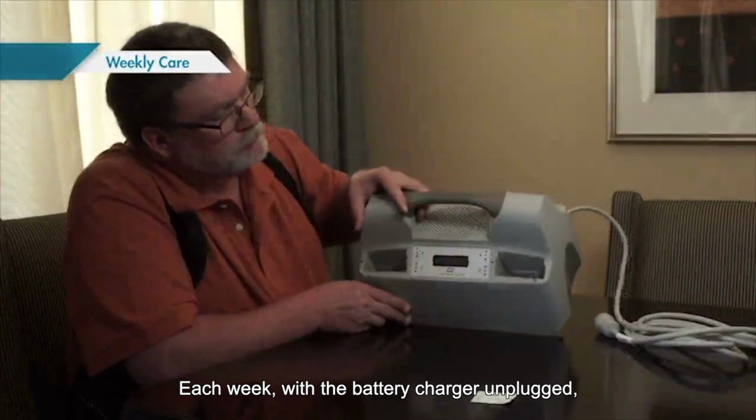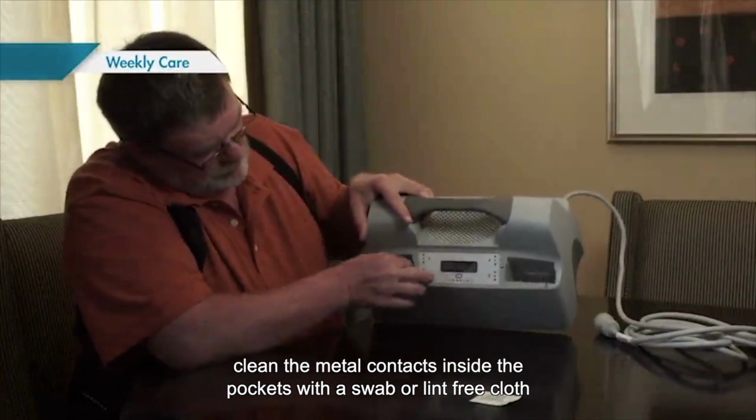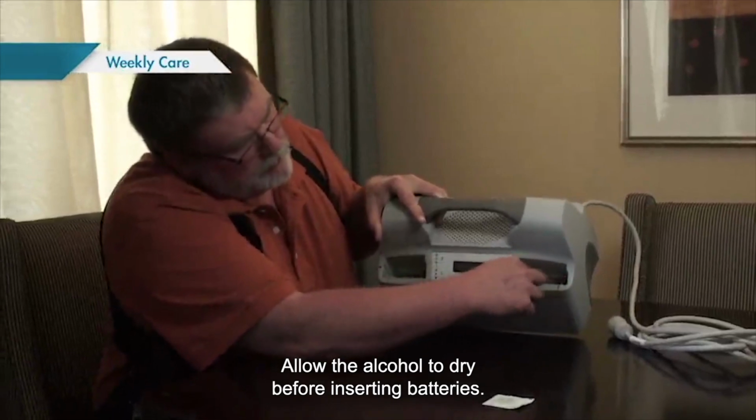Each week, with a battery charger unplugged, clean the metal contacts inside the pockets with a swab or lint-free cloth lightly moistened with rubbing alcohol. Allow the alcohol to dry before inserting batteries.